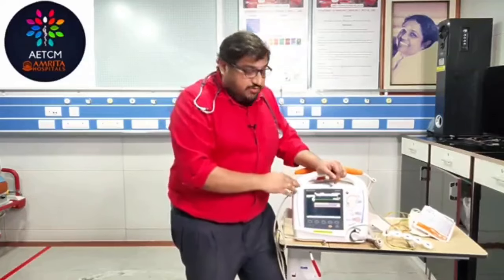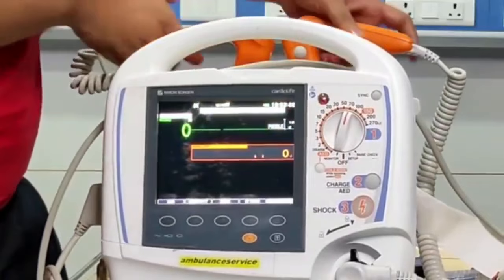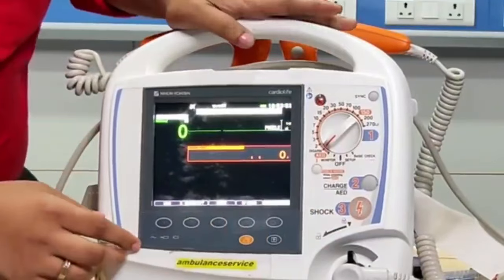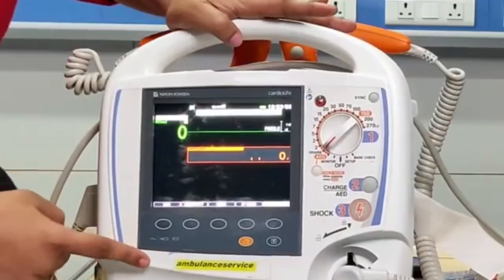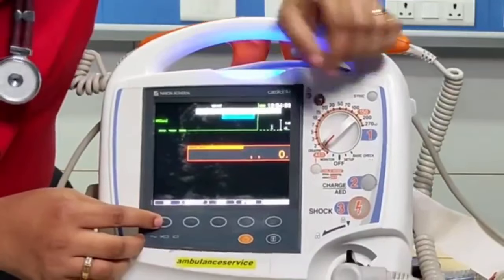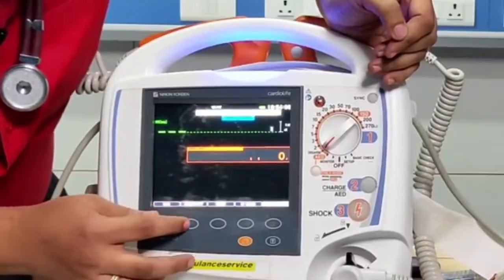So you have seen the parts of the defibrillator. I will explain it again. This is the monitor, and you have the energy selection here, and you have the paddles. I have shown you the pediatric paddles also, and it has got an AED mode. And you see here, this is the sync button, which I said is for your cardioversion. This is your synchronized button. And again, there are certain other things like lead selection here. You can select different leads. Usually we will go for lead 2 here. So lead 1, lead 2, that is what we need to select.